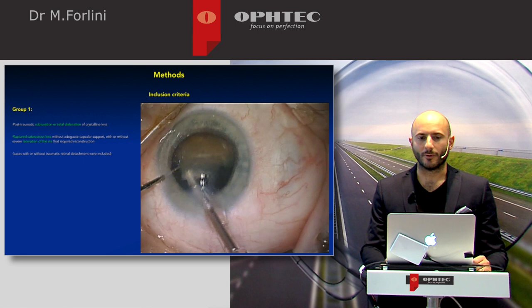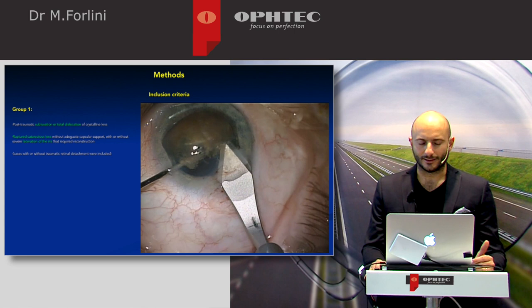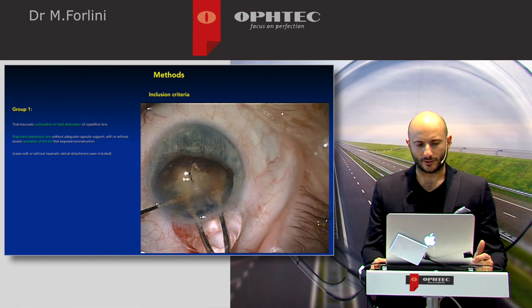In this video, you can see a sample. It was a very hard cataract and very luxated capsular support — actually, there was no more capsular support. So we had to convert the technique.